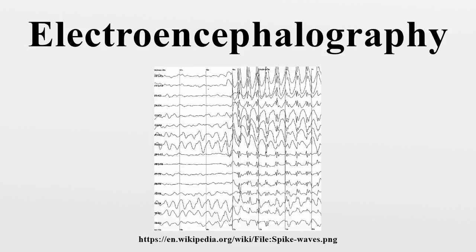Research use: EEG and the related study of EPs are used extensively in neuroscience, cognitive science, cognitive psychology, neurolinguistics and psychophysiological research. Many EEG techniques used in research are not standardized sufficiently for clinical use.